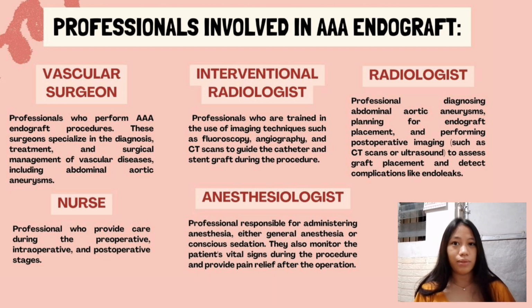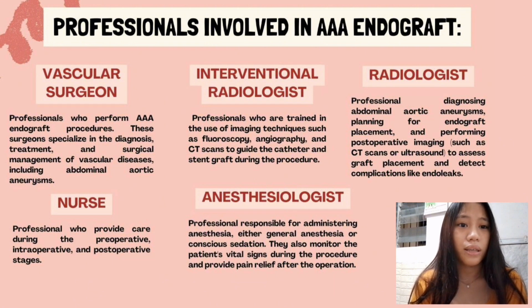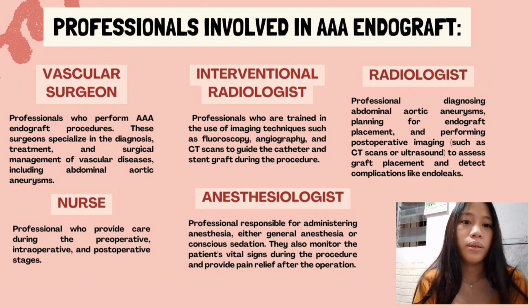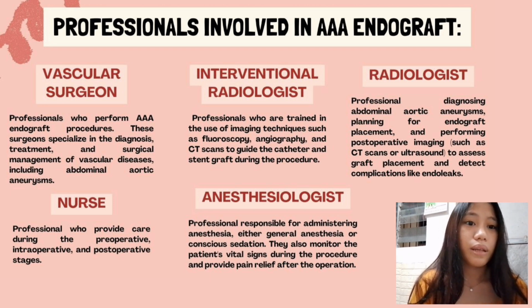Radiologists in the Philippines, especially those specializing in vascular imaging, play a critical role in diagnosing abdominal aortic aneurysm, planning for endograft placement, and performing postoperative imaging such as CT scan or ultrasound to assess graft placement and detect complications like endoleaks.